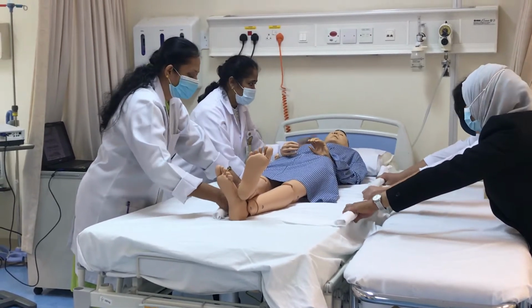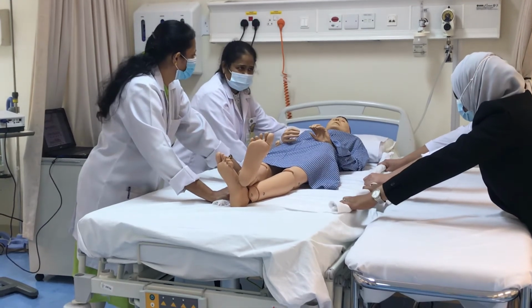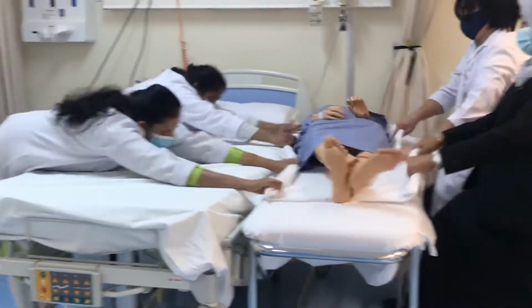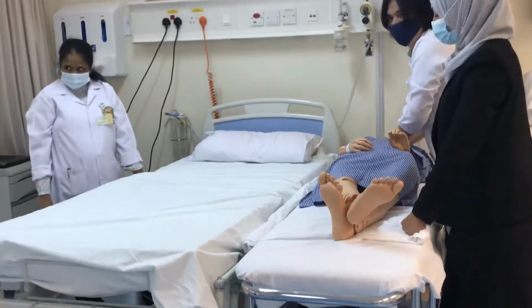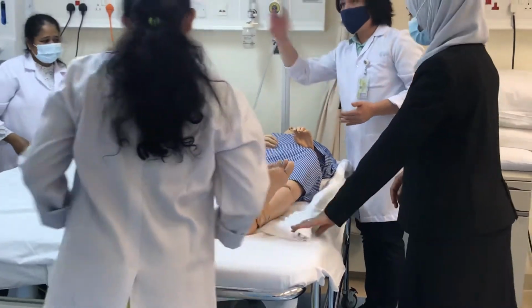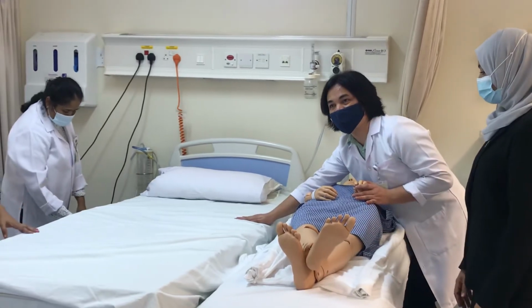If it is a normal person, they know to keep their head by themselves. No, the mannequin, they should remember to, otherwise the head will go like that. Repeating. 1, 2, 3. Oh, sorry. But in the actual patient, it will not happen. He will keep the head like this. Okay? The same process. If you want to put back the patient on the bed, you need to lower the bed at this time.